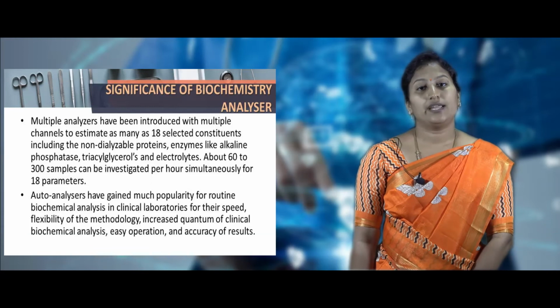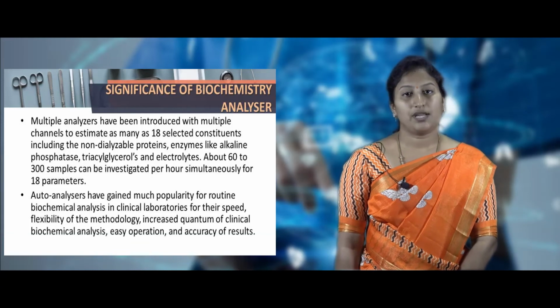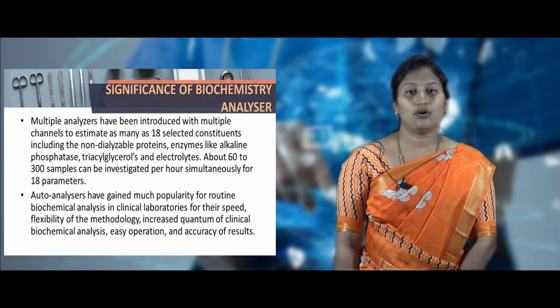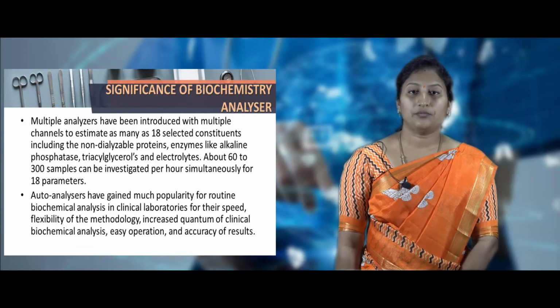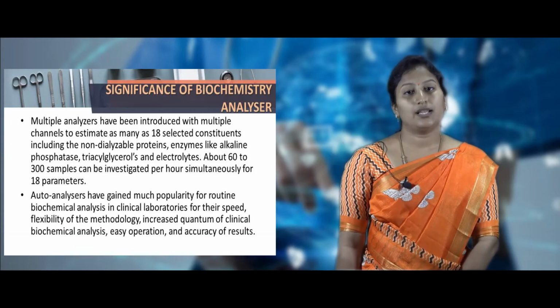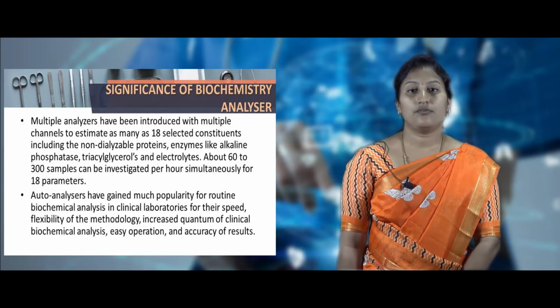Autoanalyzers have gained much popularity in routine biochemical analysis because of their speed, flexibility of methodology, increased quantum in clinical biochemical analysis, easy operation and accuracy of results.